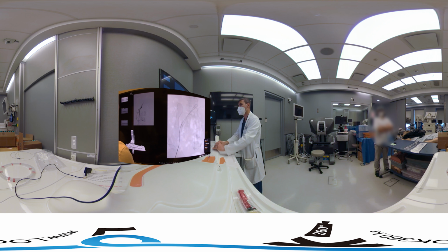Now you see it's going into our base catheter. We're going to use this to select the uterine artery that we want. Okay, so now it recognizes both. We're going to put the Tuohy-Borst on here to hold things in place. Now I'm going to fluoro so you can see it. So now you see the wire coming out of the microcatheter and the base catheter. We're going to get everything down. This looks like it's in a good position.